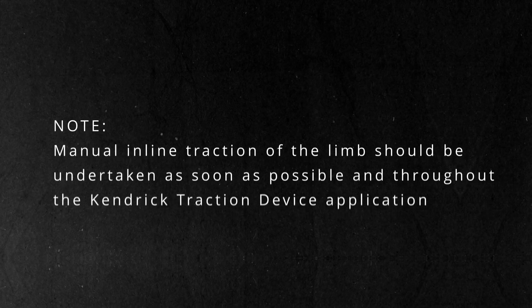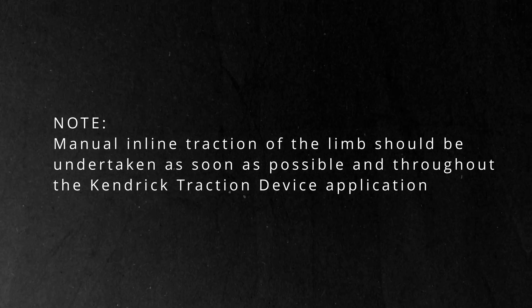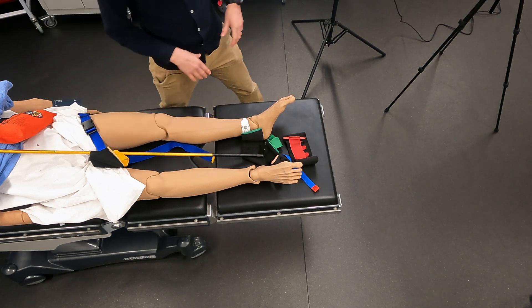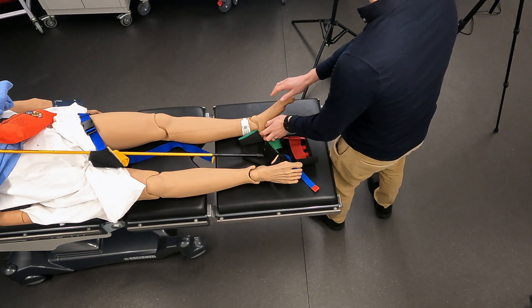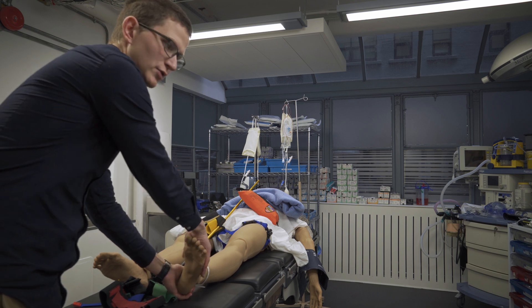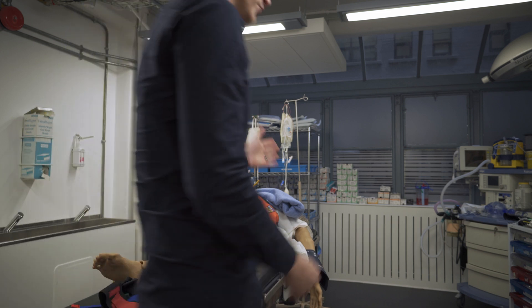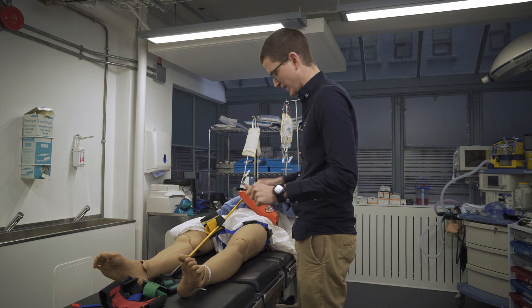We need two people to do this. What happens is that a second person pulls traction. Before we start doing much, we need to start pulling manual traction. The second person — we don't have two people here — comes along and pulls manual traction, and they do not let go of manual traction. That is where we align the femur, which limits the bleeding, and they hold manual traction the whole time.